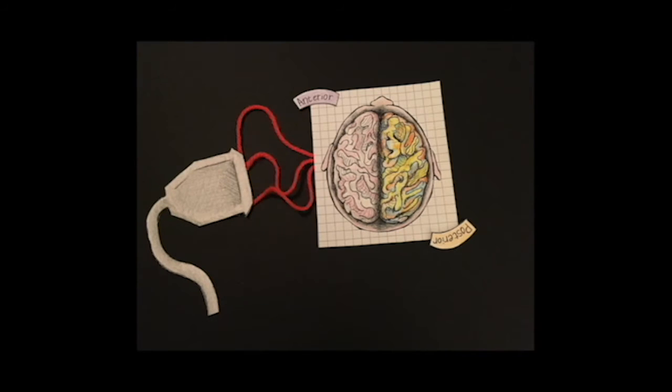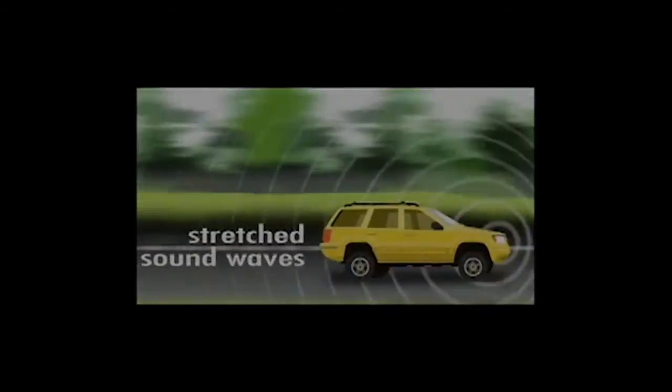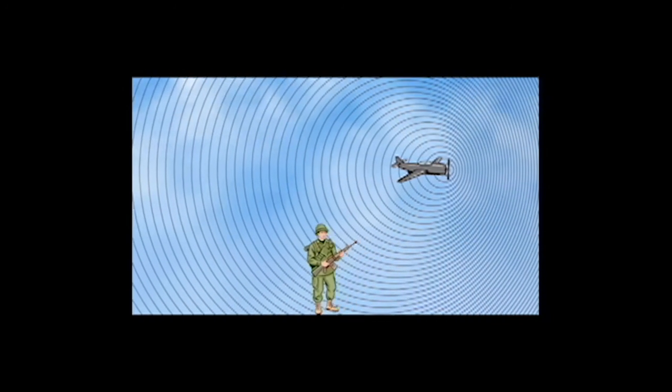The second principle used is the Doppler effect. Most people are familiar with the phenomenon of the sound of a car getting higher pitched as it moves towards the listener and then lower pitched as it moves away. This is due to the sound waves compressing, shortening the wavelength and increasing the pitch as the object moves towards the observer, then stretching out, increasing the wavelength and decreasing the pitch.